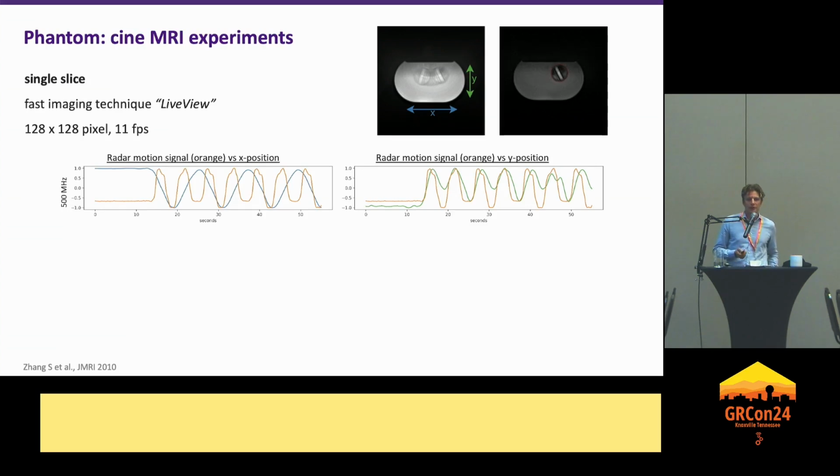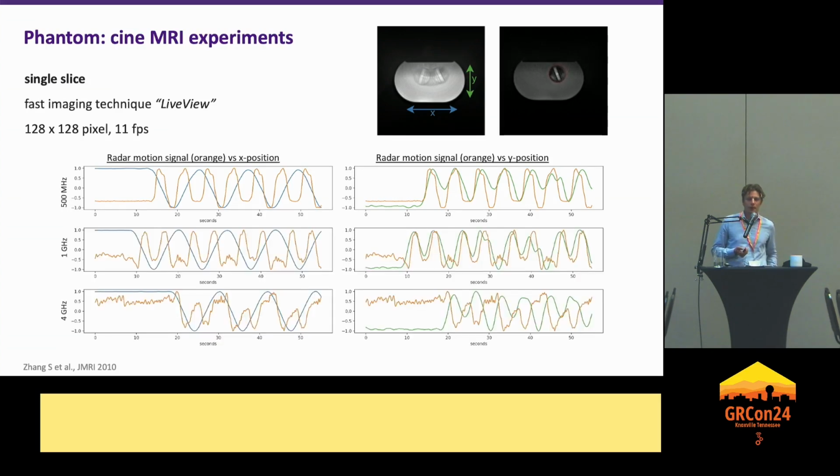If we jump to higher frequencies, there's still a signal, but it gets noisier. So you can already appreciate that the optimal parameters are kind of frequency dependent and might need tuning, optimization, depending on the application.